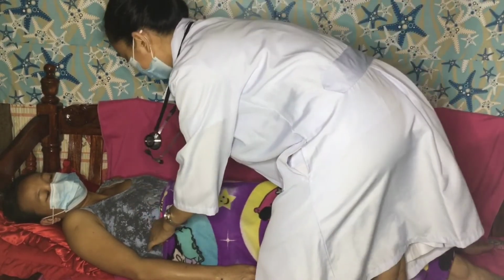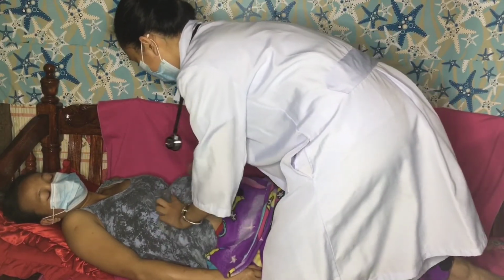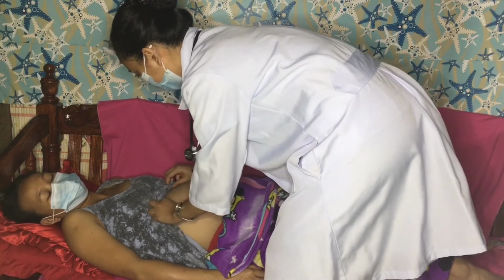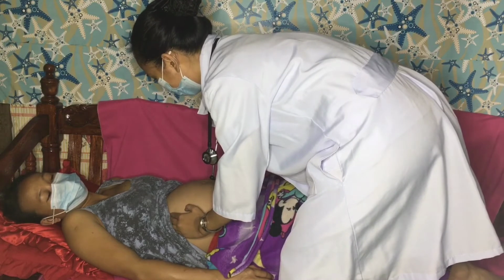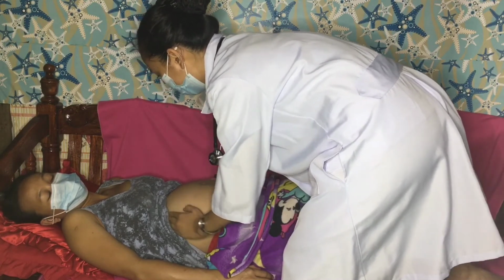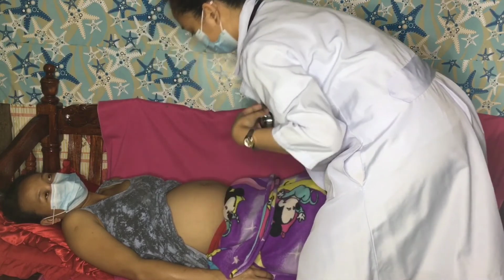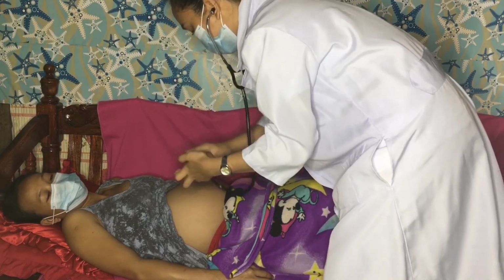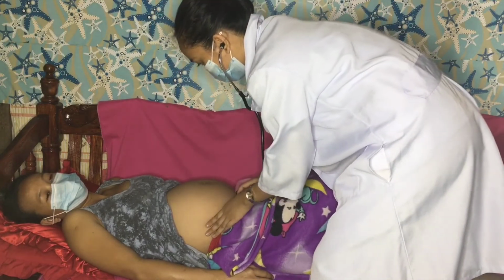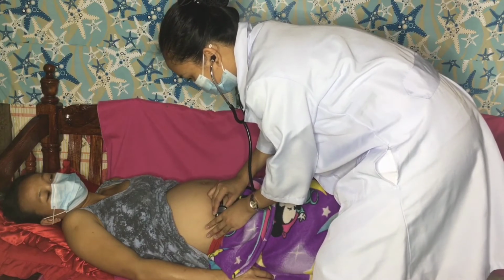After knowing the position of the fetus, we're now at the last procedure, which is auscultating the fetal heart rate. Make sure that you have your stethoscope with you before proceeding. Place the bell side of the stethoscope chest piece on the fetus's convex portion, closest to the anterior uterine wall. Listen by pressing it firmly and very gently. Count for a full minute while holding the stethoscope chest piece, while the other hand feels the client's radial pulse.